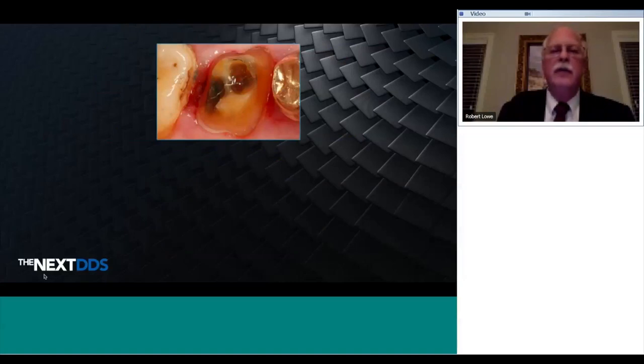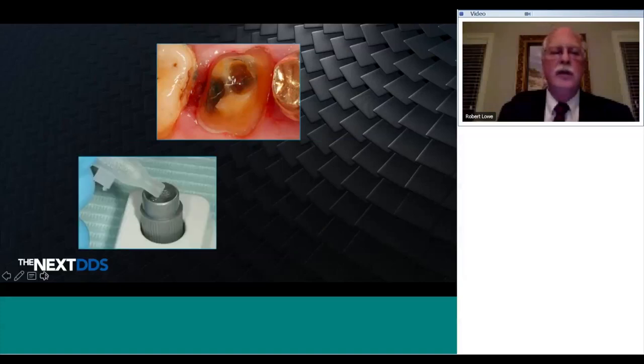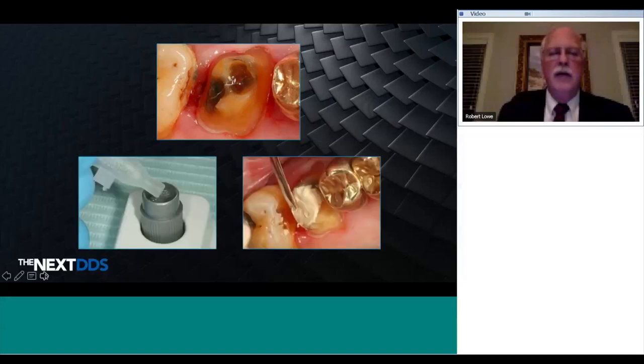Sometimes we take out an old filling and we have a crack. We don't know whether that crack or fracture extends to the pulp or not. We now also have biologically active materials that we can use for buildups. This is Biodentine. Biodentine is tricalcium silicate. Tricalcium silicate can be used over a direct pulp exposure. So this is a bioactive buildup material that would be, in my opinion, indicated for a situation that you see on the slide.